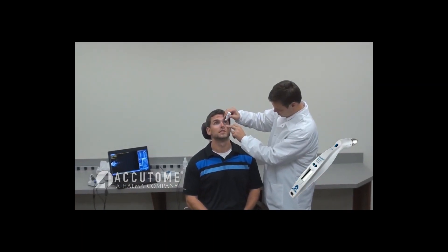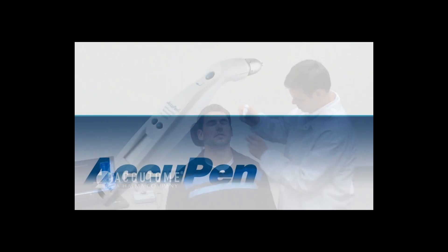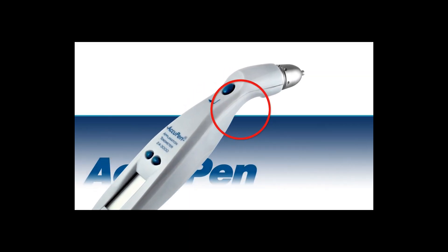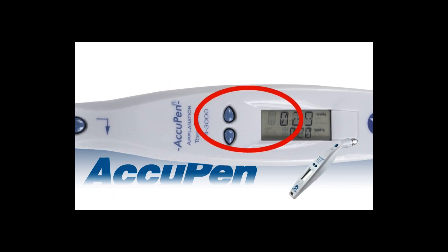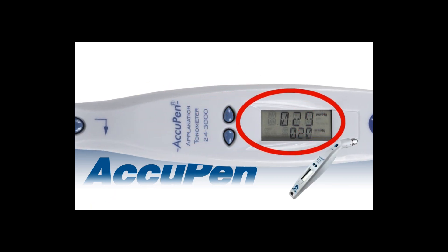First, anesthetize the patient's eye. To turn on the AccuPen, press and release any of the control buttons. The unit will show a display on the screen and beep twice when ready for use.